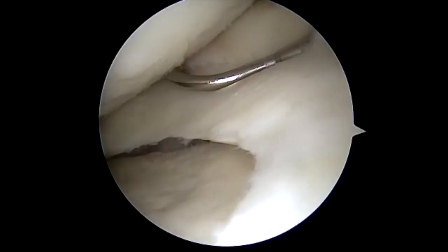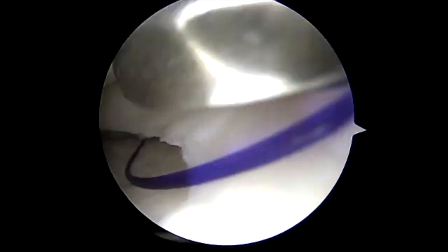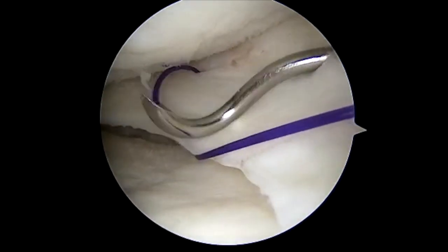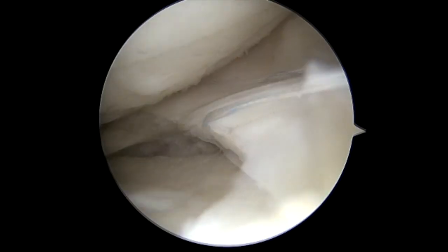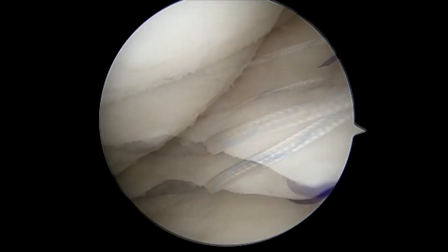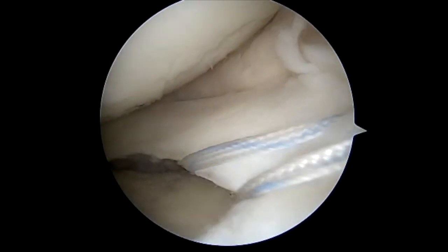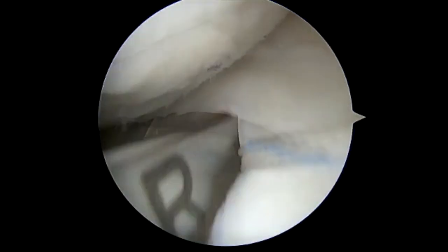We have a cannula in there and we make an anterior medial portal. We use a suture passer with PDS suture to pass the Smith & Nephew tape through the meniscus — this is more of a central to slightly posterior placement. Following this, we place the passer again in the meniscus slightly more anterior, roughly one centimeter spacing, and pass the same suture in a horizontal mattress with the tails facing down. The nice thing about the Smith & Nephew passer is that it comes with two cannulated systems — one for the root medially and one for the medial edge of the extrusion stitch.